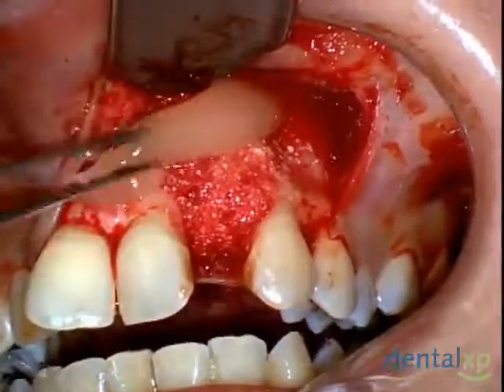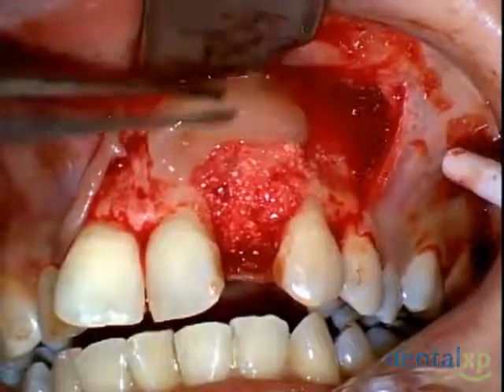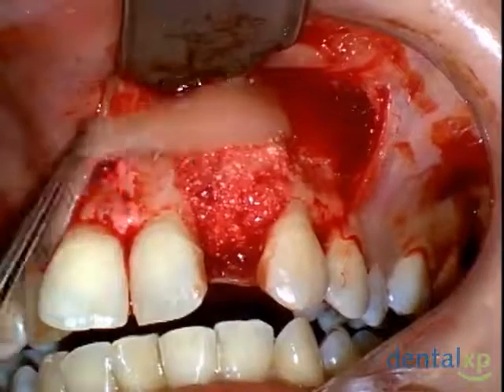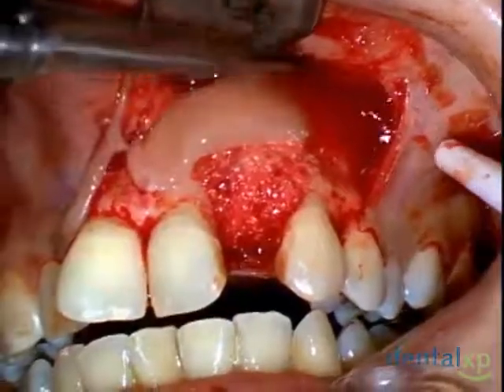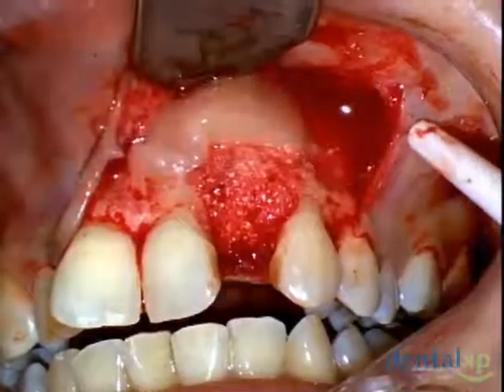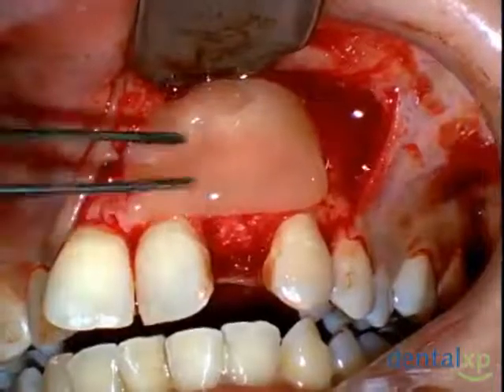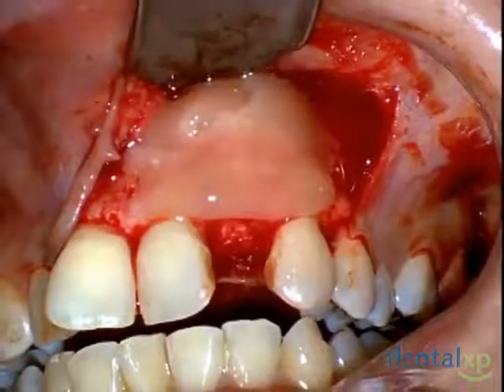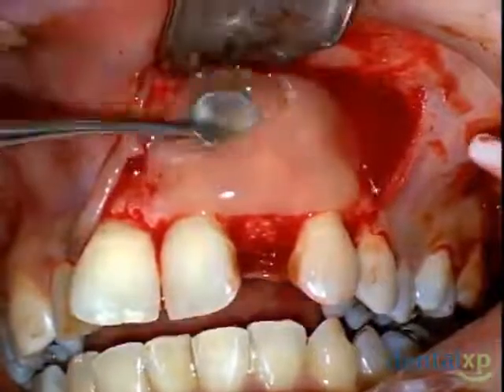And then the layers of fibrin that are created from the PRGF protocol. These are autologous and created from the patient's own blood and can be harvested in layers and utilized as an autologous membrane barrier. So it has a membrane barrier function that allows us to protect the bone graft from the outer flap during the initial healing.